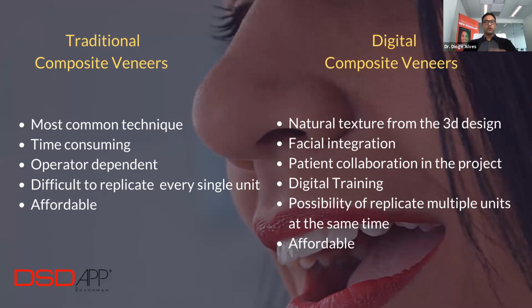Another benefit of doing the digital composite veneers is that you can have the patient's collaboration in the project. And I will show you guys later how that works. But one of the greatest things is that you can have the patient be a co-designer of their own smile. And that is something that engages the patient from the minute you start talking to them. Absolutely. That's a huge part of emotional dentistry, a huge key in it. And I love that. That's my favorite part.